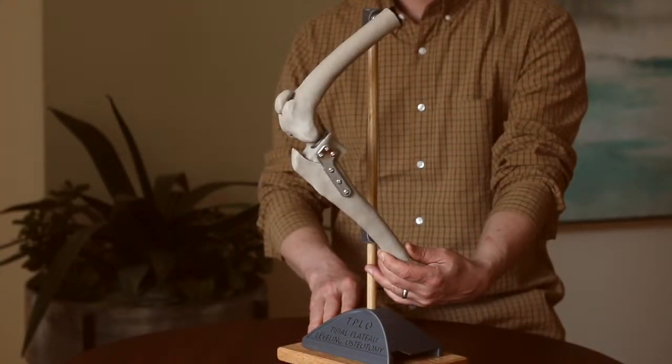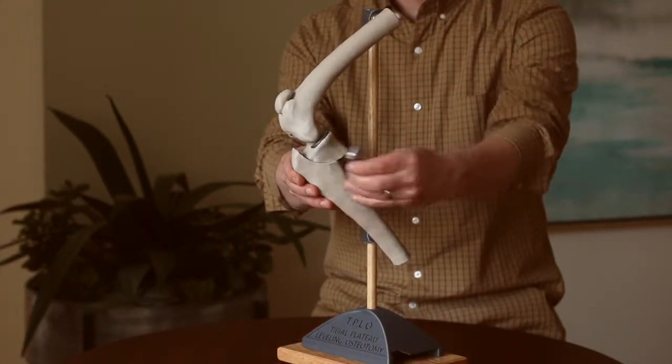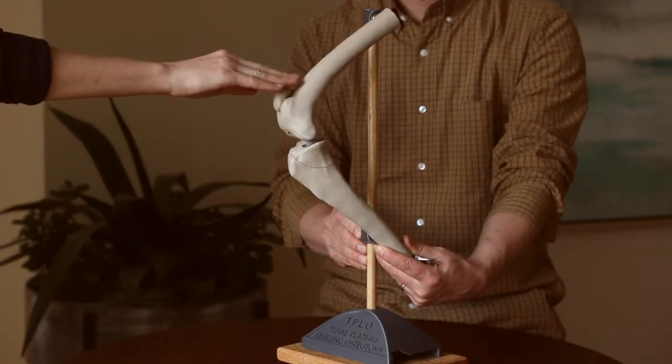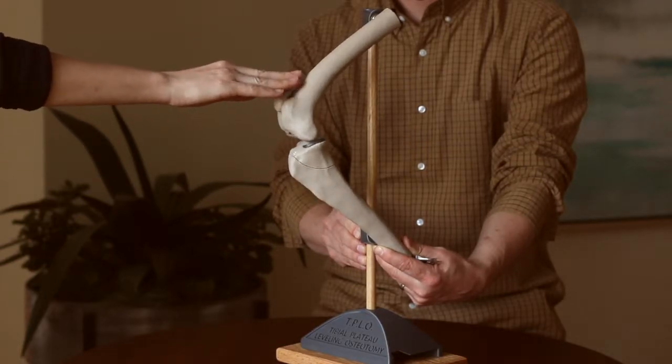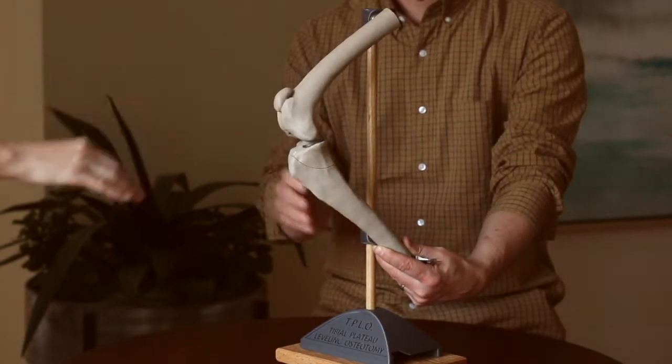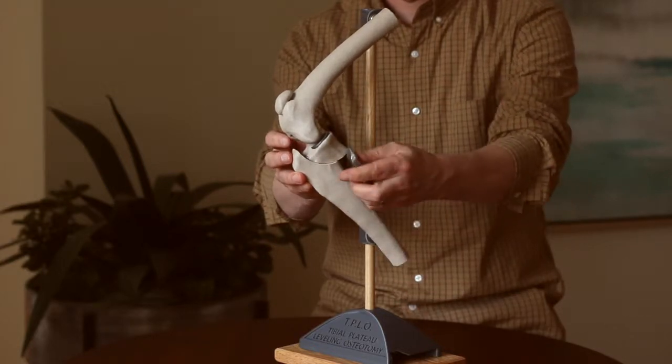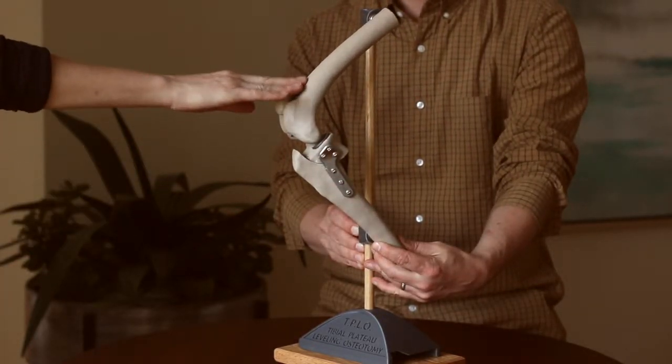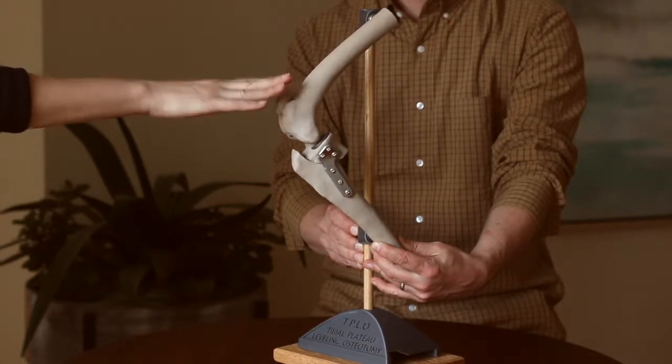So I can demonstrate those two different situations here. This is with the ligament torn but before surgery, and you can see every time the dog steps down you get this shifting. And then after surgery when the TPLO is complete, you can see that now in weight bearing the joint is stable and it's no longer shifting back and forth.